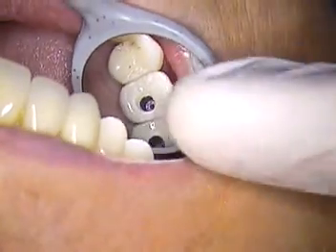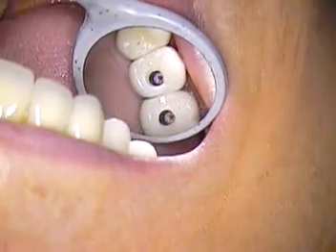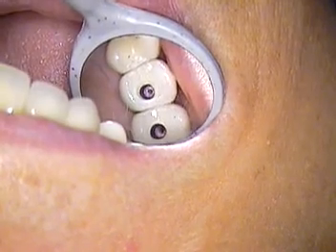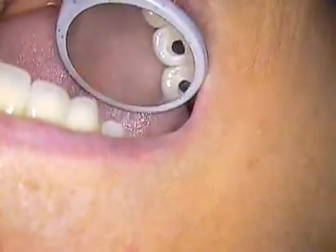Re-tighten one more time to 35, and you're done. Now you know you haven't put excessive stress, other than vertical stress, on the screw threads. You really don't want to be forcing a contact and having a real issue. Laboratories need to do that too — hand-tighten all the way down. Don't make it a loose screw. And don't be afraid that you're tightening the model too much. You need to do that. Not to use a wrench, but your hand-tightening is fine.